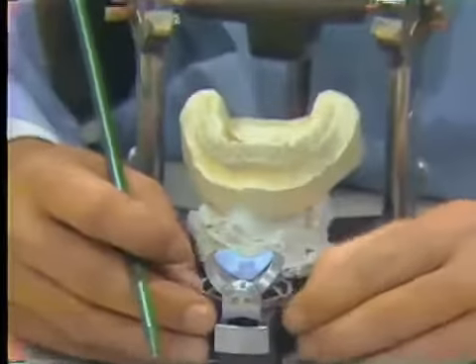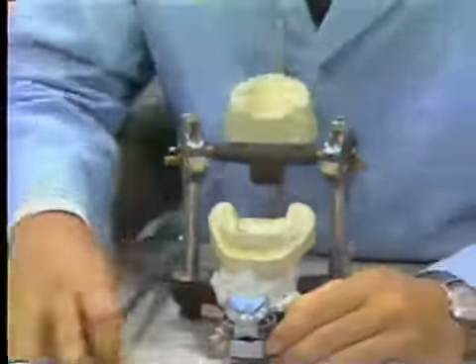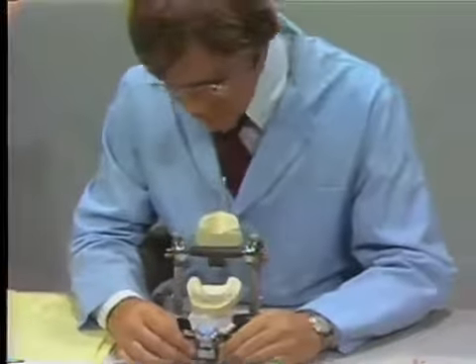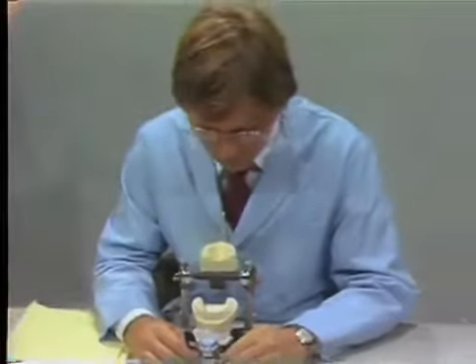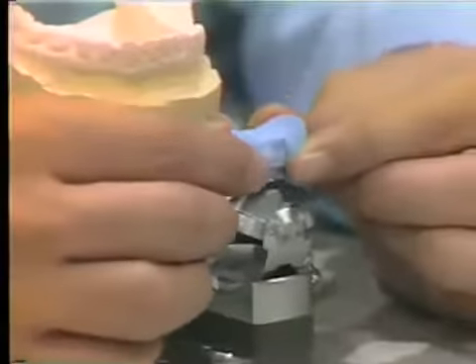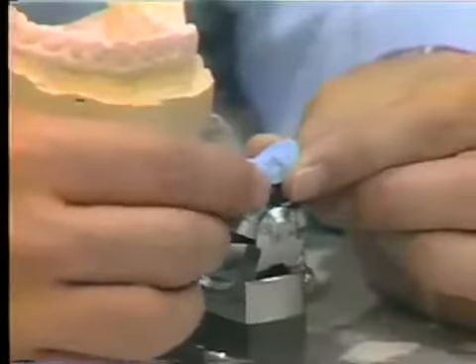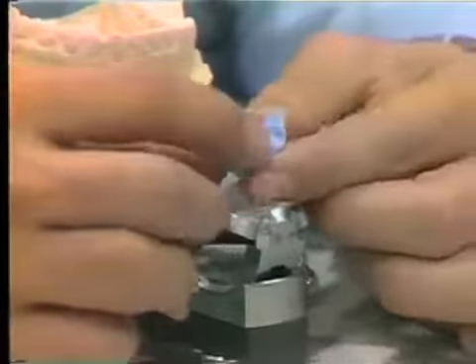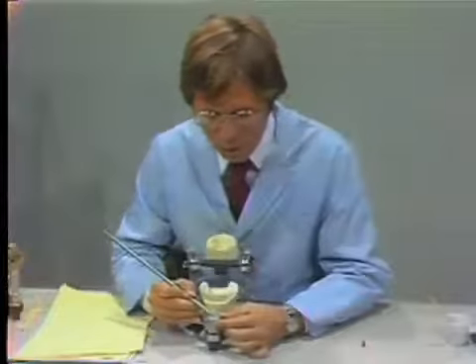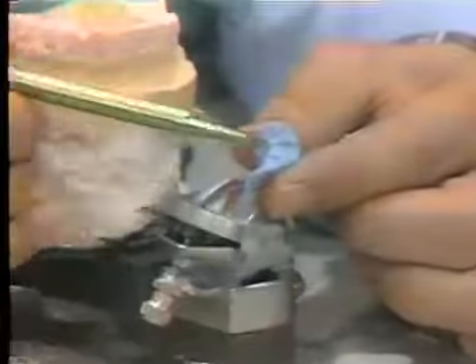Now, after it is set, we can lower the lateral incisal guides and break loose our mount, or our little customized guide. We can then take it in our hands, trim it back so that we have this little plateau beyond the end-to-end relationship.